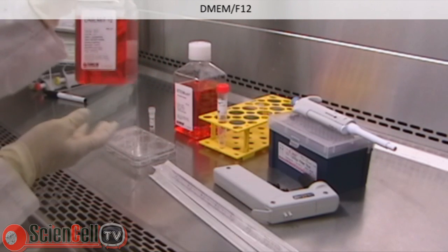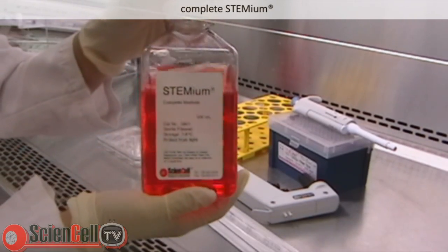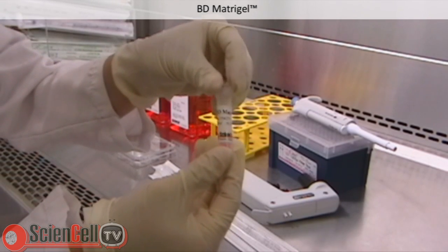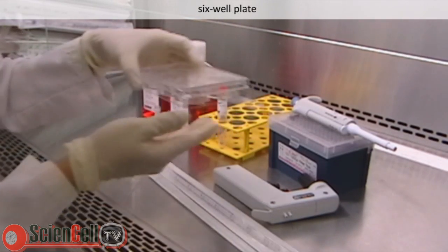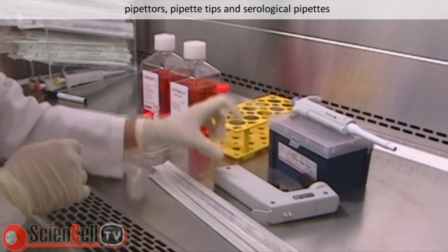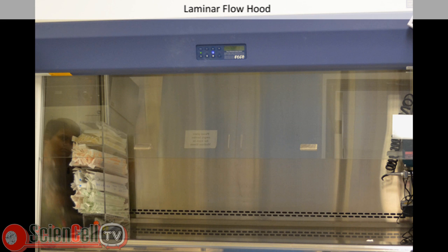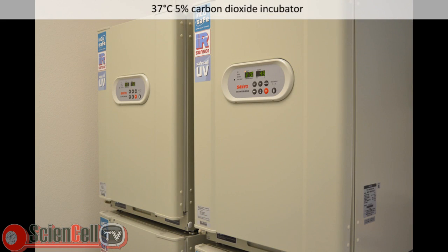The following reagents are required: DMEM/F12, complete Stemium, an aliquot of BD Matrigel, a 6-well plate, pipetters, pipette tips, and serological pipettes, a conical tube, laminar flow hood, and a 37 degrees Celsius 5% carbon dioxide incubator.